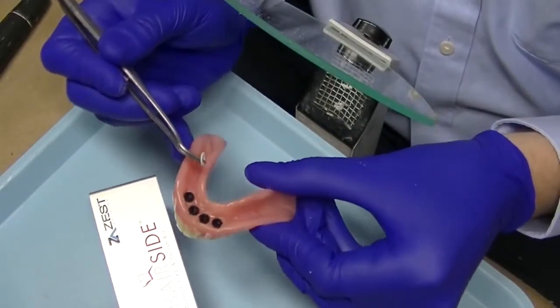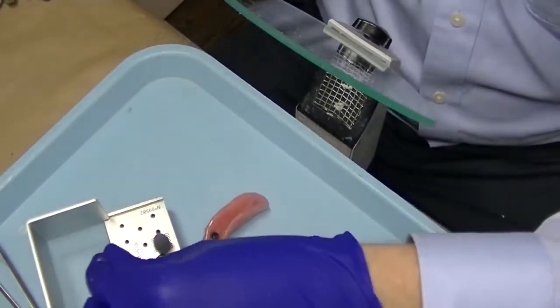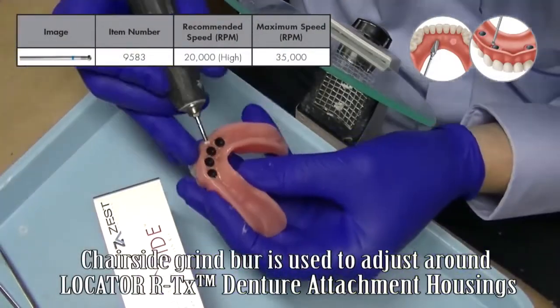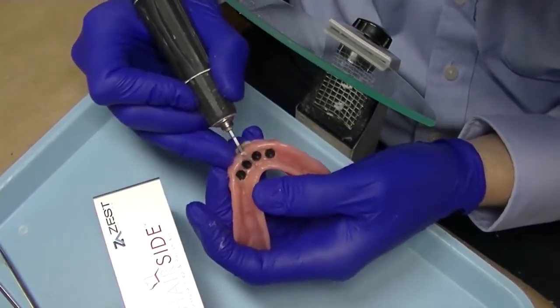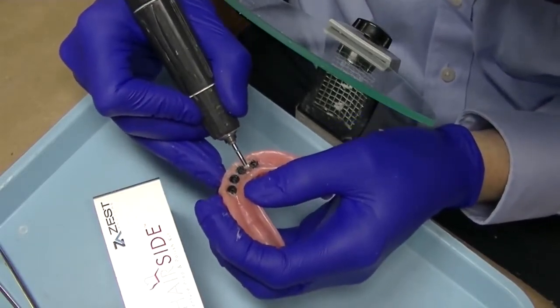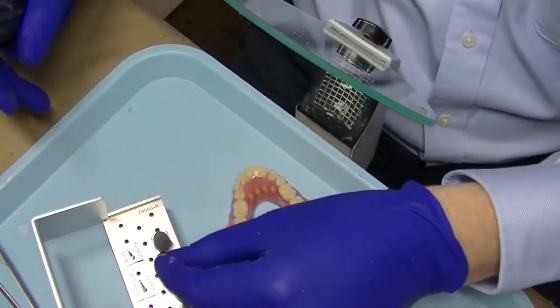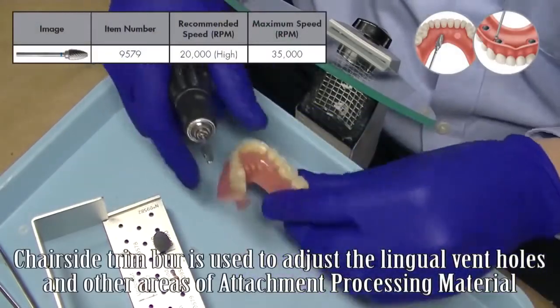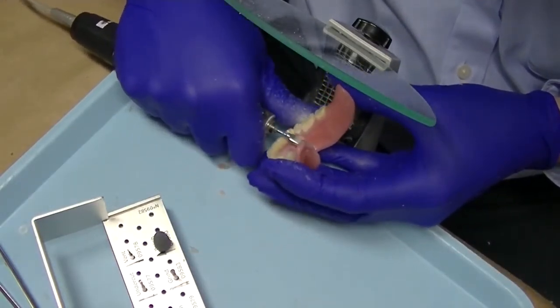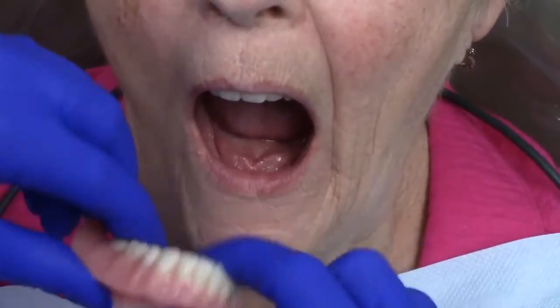Taking the denture to the laboratory, I clean up any areas of resin flash in and around the complete denture or RTX housing. The chair side grind burr is a specialized round burr perfectly suited for trimming areas of the chair side attachment processing resin in and around the Locator RTX housing, removing just the necessary amount of flash without damaging the denture. The chair side trim burr is then used for trimming the lingual or palatal portion of the denture and any areas of vent hole excess.